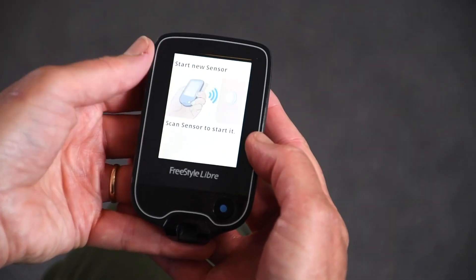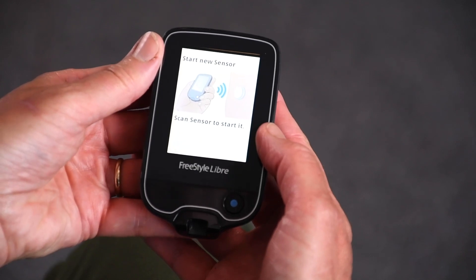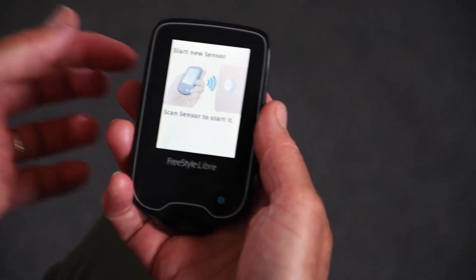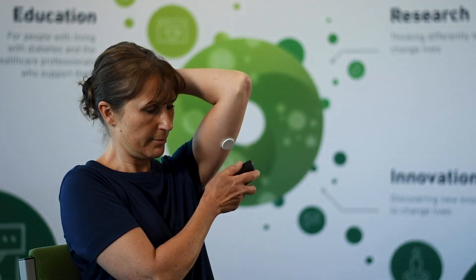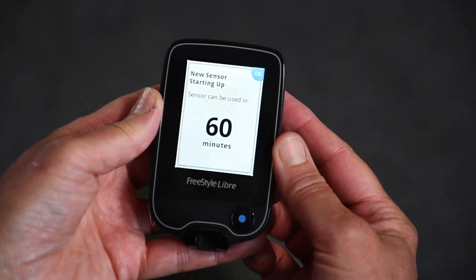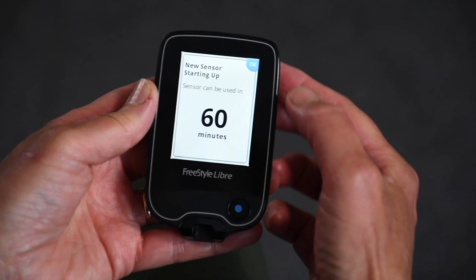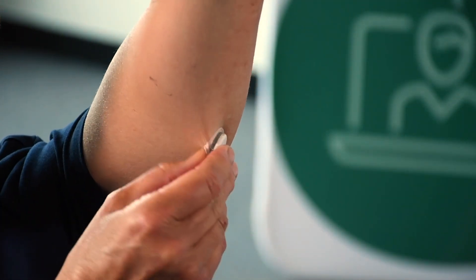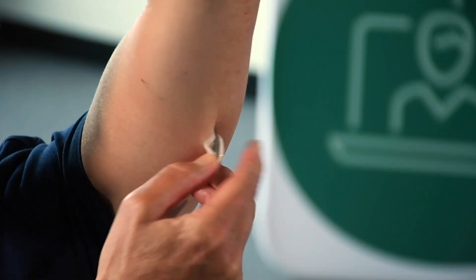At the moment you haven't got any history, so press 'new sensor' and then move the reader to your arm where the sensor is and wave it over the sensor. It will show on the screen that in 60 minutes you will be able to scan to your heart's content. The sensor lasts for two weeks and when you need to change it, you just peel it off like a plaster.